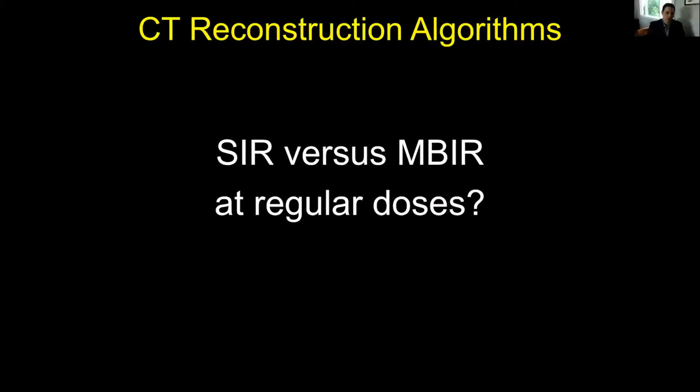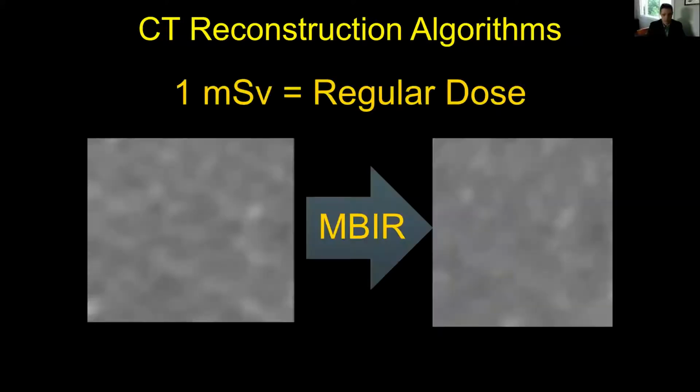So what about making some comparisons between the two most fancy reconstruction methods, SIR and MBIR? So let's look at regular doses.